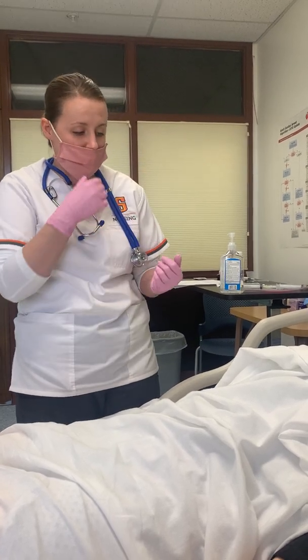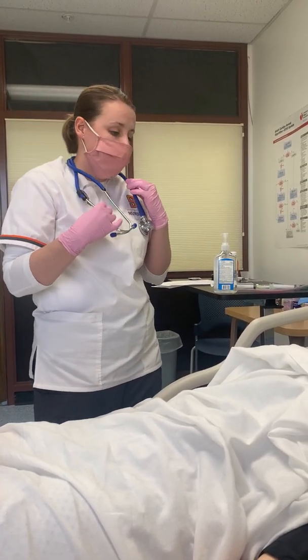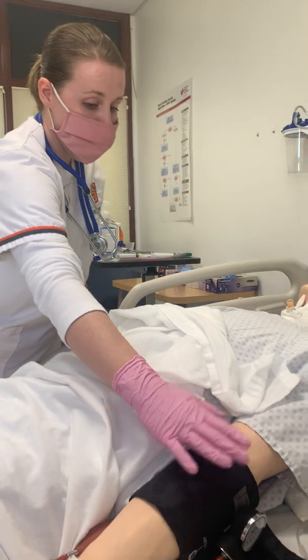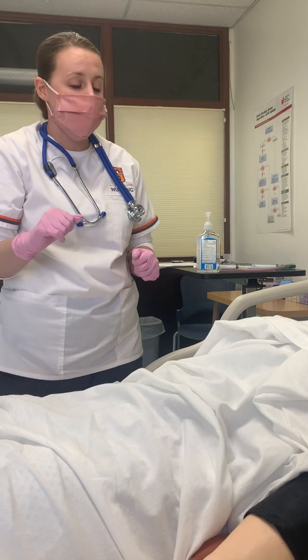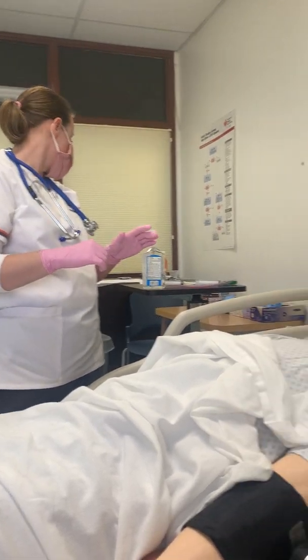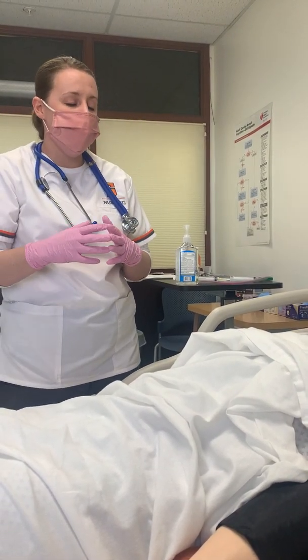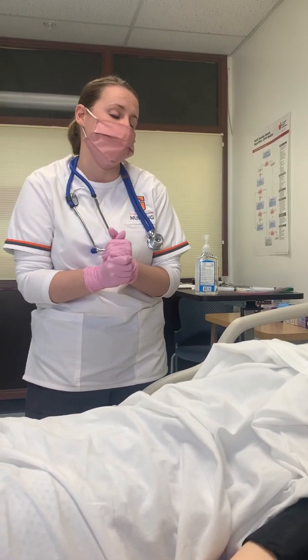And I'm going to explain what I want to do. I want to do a head-to-toe assessment with Addie, and I want you guys to ask me any questions if you have any throughout any part of the procedure. And I want to get a set of vitals to start. So I would put on her blood pressure cuff right here, and her blood pressure is 146/72. So Addie's got a high blood pressure, and I think that is due to her high pain. And I'm going to check her temperature, and that comes in at 39.5. So she's got a good fever, and we're going to give her some medication to help with that.